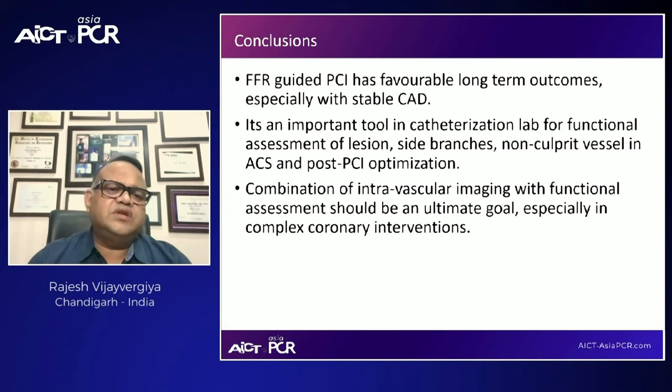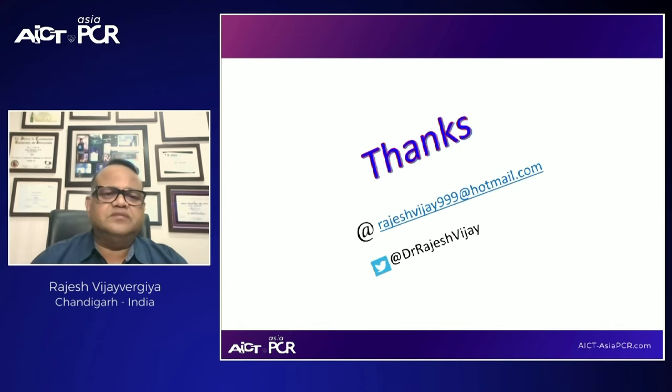So in conclusion, FFR-guided PCI has a favorable long-term outcome, especially in those with stable coronary artery disease. It's an important tool in the catheterization lab for functional assessment of the lesion, side branch assessment like in left main bifurcation disease, non-culprit vessels in acute coronary syndrome, and also in post-PCI optimization. A combination of intravascular imaging with functional assessment should be an ultimate goal, especially in those with a complex coronary intervention.